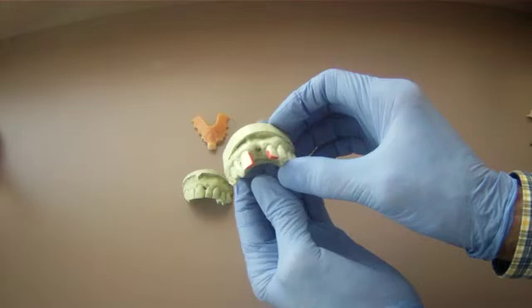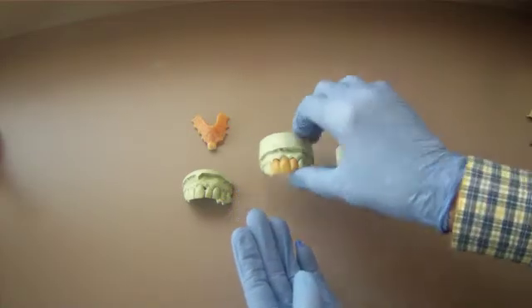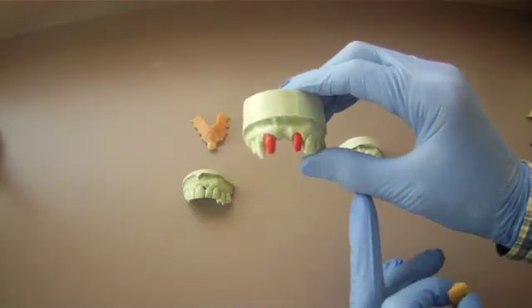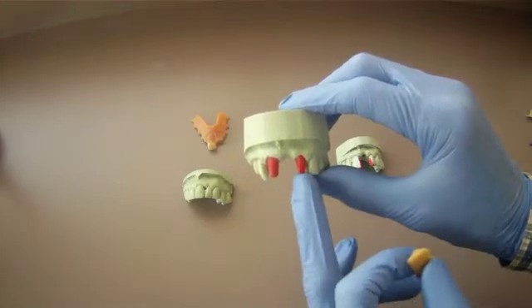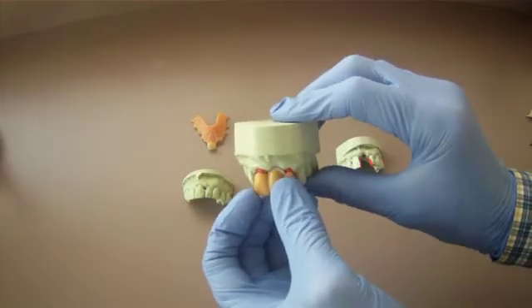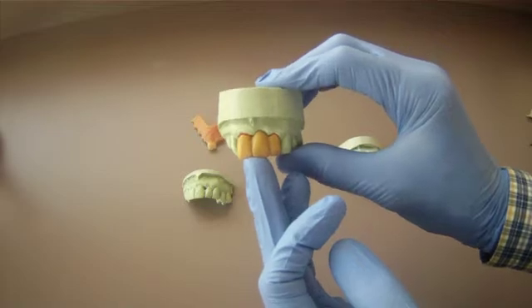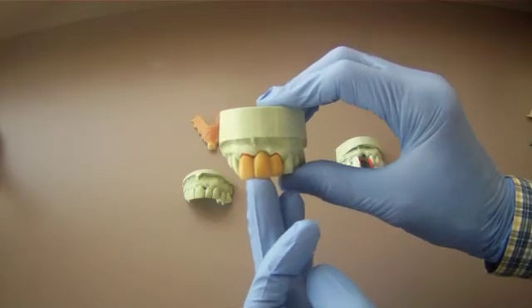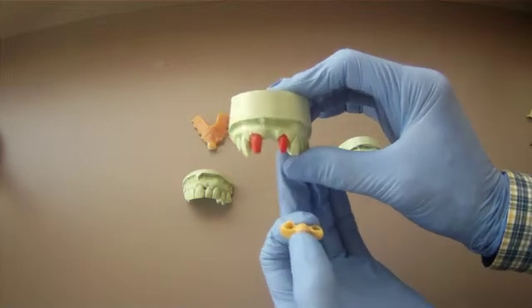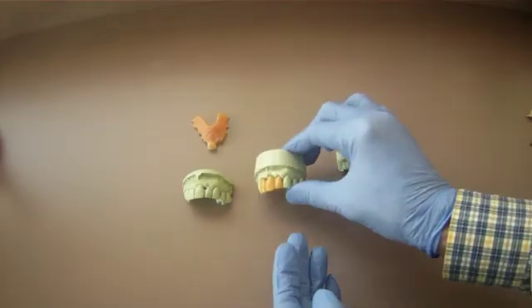The next alternative is what we call a traditional fixed bridge. That's an orthodox bridge, and I'm going to show you that. This is what it looks like when we're done with it. Of course, these are models, but basically what we have to do before we do the bridge is take the two natural teeth and make cone preparations or pencil-shaped preparations so the bridge can slide in and off easily and then attach to the teeth with some type of a cementing medium. We call that an adhesive or a bonding agent. In the general vernacular of people, it's called a glue, but we don't use that term in dentistry. So this is what a traditional orthodox fixed bridge work is made of.